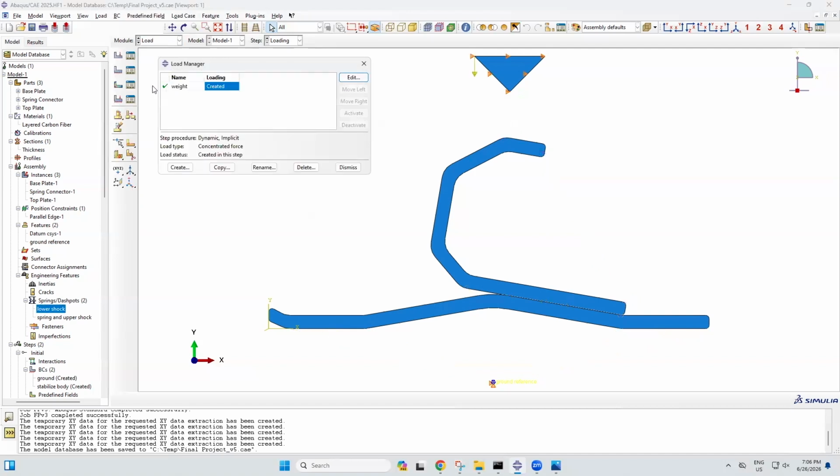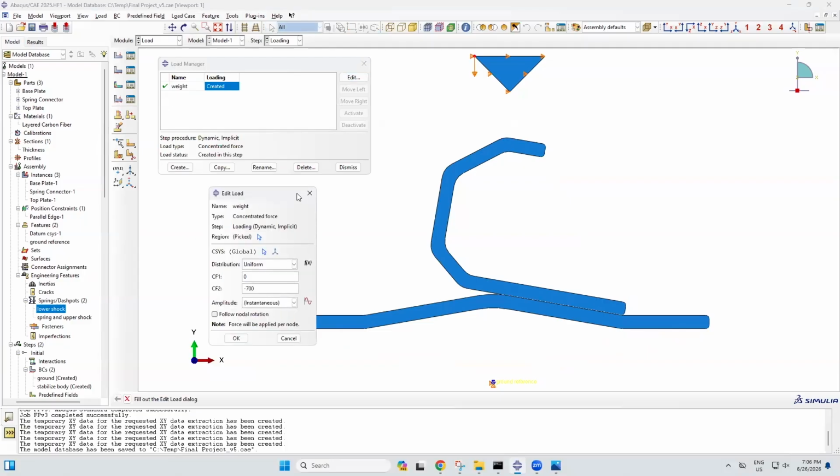Next is the loads, and I created one load and two boundary conditions. The load I created, I called the weight, and it is negative 700 newtons to represent the overall body weight. And I applied it to the spring connector. By applying it to the spring connector, it represents what the lower limb would apply to the foot prosthetic and create a realistic deformation and applied load.